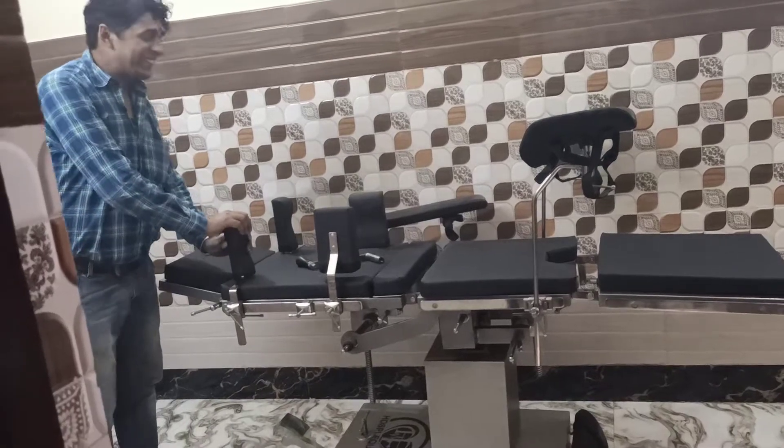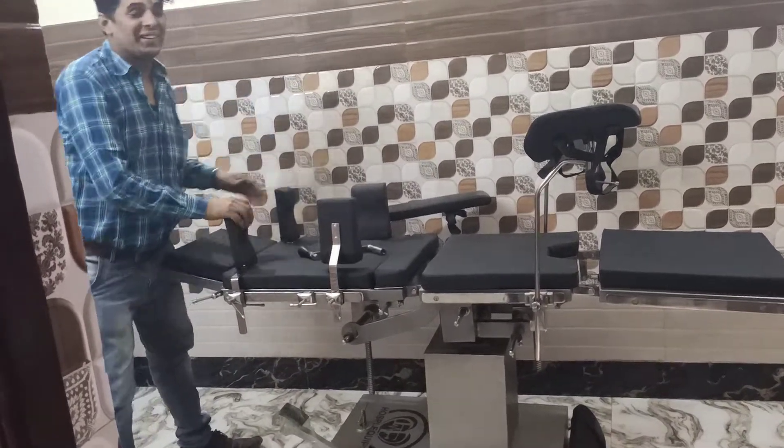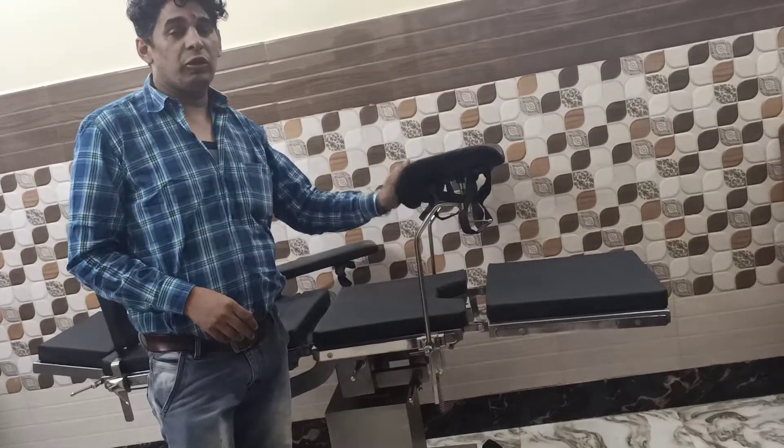Two shoulder support, and two arm sides. Two cradles for leg support. Very good.